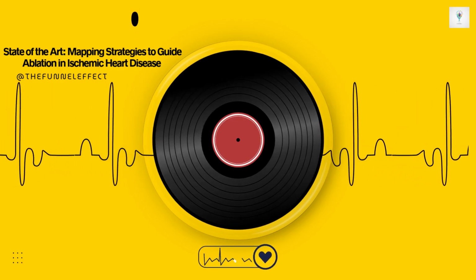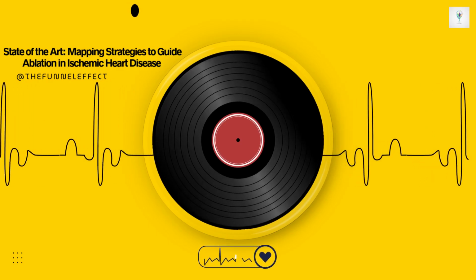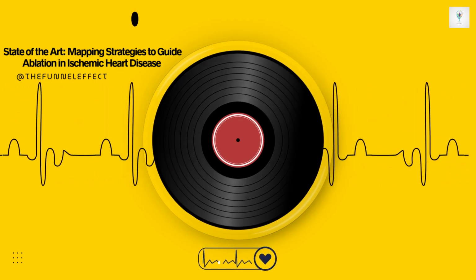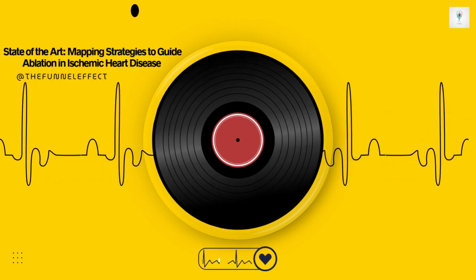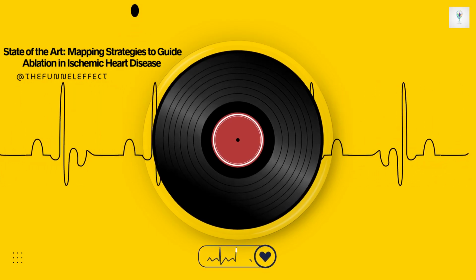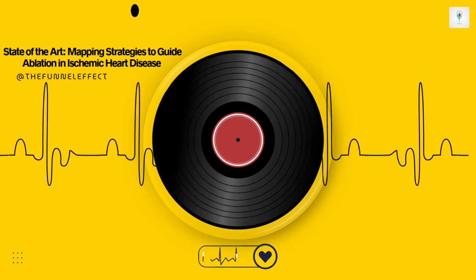That's the idea. Targeting these specific multi-component signals, a strategy sometimes called dechanneling, aims to be more specific than just targeting any LP. The hope is to hit the crucial transition points, the doorways into and out of the isthmus. It's shown some success, allowing ablation of many inducible VTs in studies.